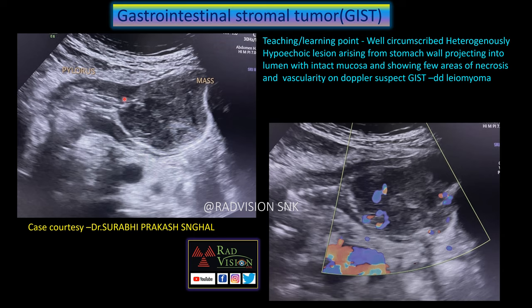Next case: a hypoechoic lesion arising from the wall of the stomach with intact mucosa, projecting towards the lumen, making an obtuse angle with the stomach wall, and showing vascularity on color Doppler. Whenever you see a heterogeneous hypoechoic lesion with intact mucosa arising from the wall, projecting into the lumen with raised vascularity, cystic areas, and an obtuse angle with the stomach wall, definitely suspect GIST. The close differential is leiomyoma. Thanks to Dr. Surmay Prakha Singal for contributing this case.